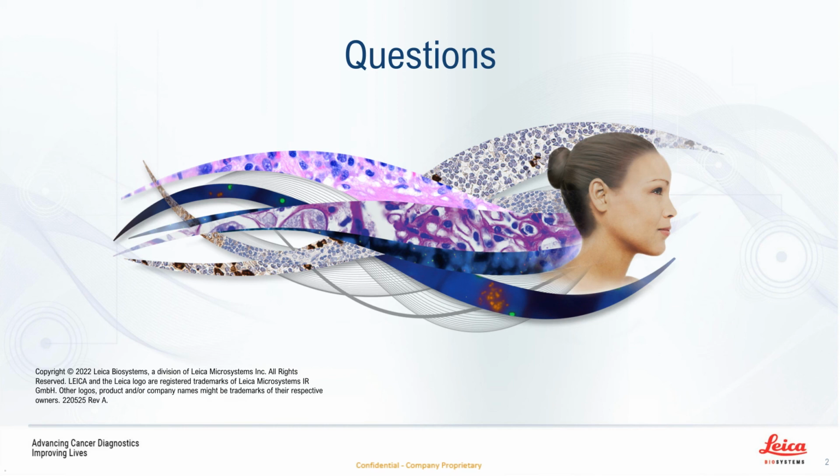The other type is where you've got a 2D image capture rather than a line scanner. Quite often they will focus again for every 2D frame, an XY section. Depending on how many frames that piece of debris would overlap into, would determine how much, or if, any of that image is out of focus. So I hope that helps to at least provide some guidance.